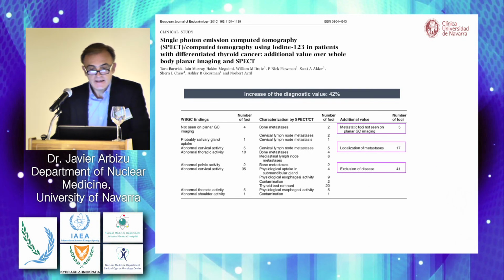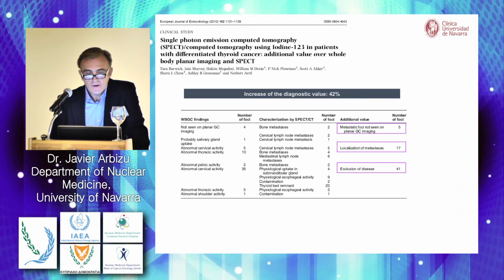In this study, they look at the additional value in terms of metastatic foci or localization of metastasis, what is increased when compared with the normal findings in the whole body scan.